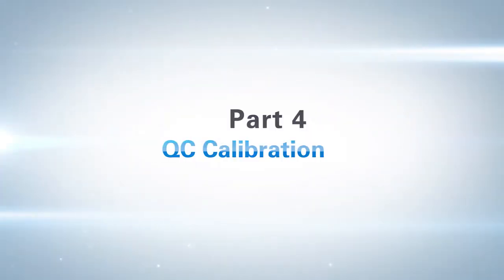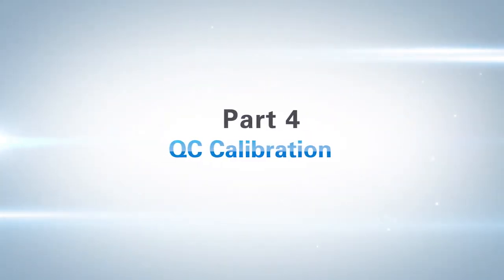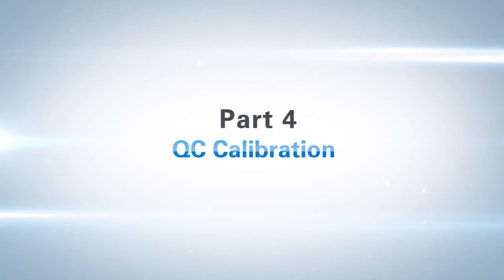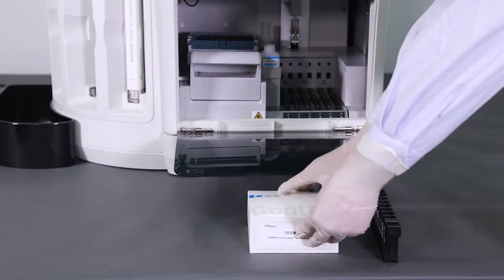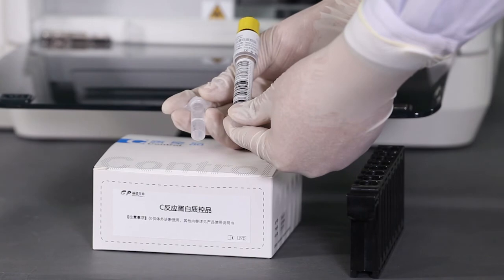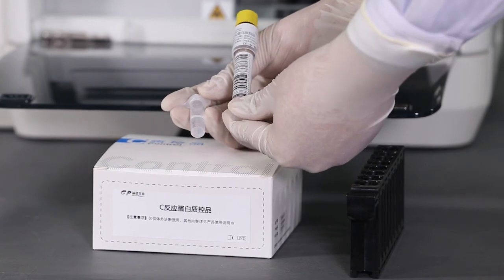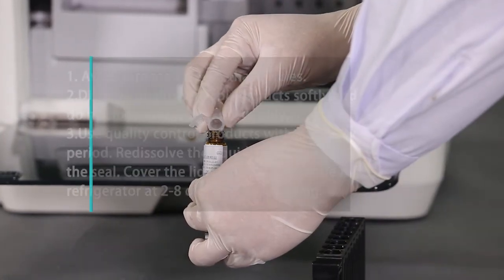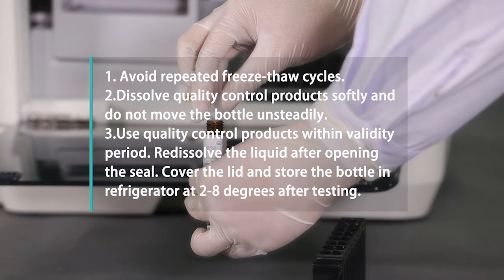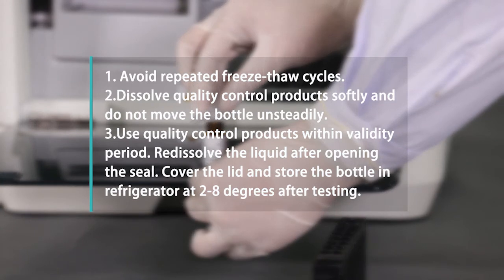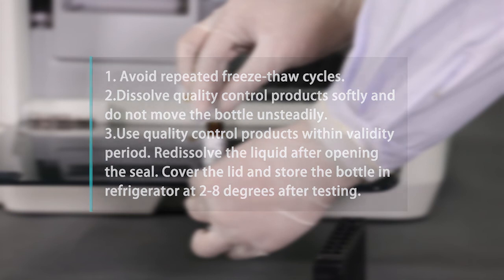Part 4: QC calibration. Users can perform quality control testing in QC interface. 1. Avoid repeated freeze-thaw cycles. 2. Dissolve quality control product softly and do not move the bottle unsteadily. 3. Use quality control products within validity period. 4. Re-dissolve the liquid after opening the seal. 5. Cover the lid and store the bottle in refrigerator at 2 to 8 degrees after testing.